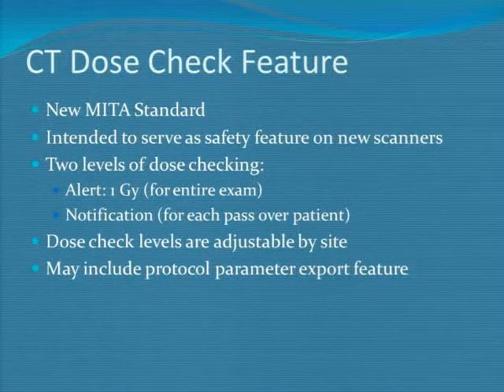So if you don't have a fairly new scanner, you might not be aware of this. If you have a scanner that's come out in the last, I'd say, year or two, it probably has this on there. You may or may not be aware of it. It tends not to trip until you hit one of these alert levels. And if you don't do a lot of really high dose kinds of exams, you might never trip it and might not even know it's on there, because it tends to be very silent and invisible until you stumble over it. So the CT dose check feature came out of MITA.